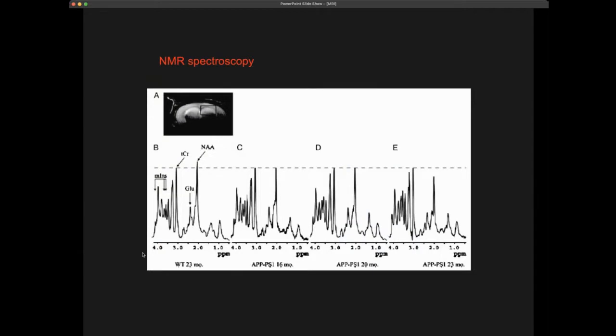Now, just like in the lab, as I told you before, you can use MRI for spectroscopy, because every different molecule has a slightly different resonance frequency, and so a slightly different RF frequency is used to do it. We can also do this image-based, and select certain voxels to look at the chemical composition. So not only looking at water and the dynamics or the amount of water, but really trying to specifically target different metabolites.